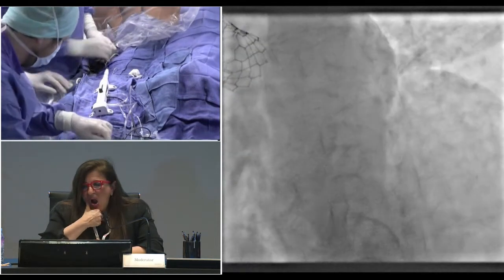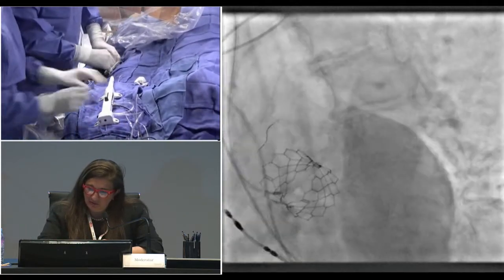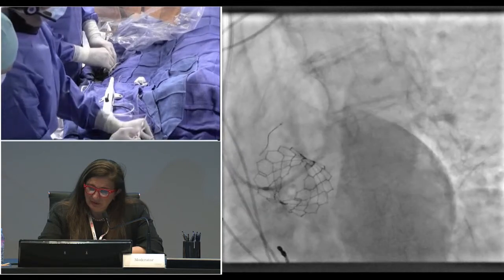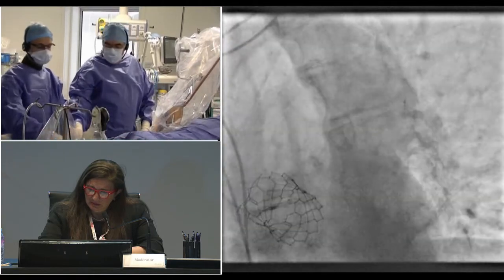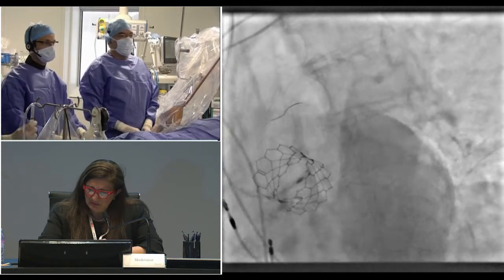So you can see that lesions induced by radiation are very calcified, very fibrotic. That's always difficult to treat. Test? Yeah, a lot. Okay, so it's fine. So I just advance. Attention, pas plus. J'avance.